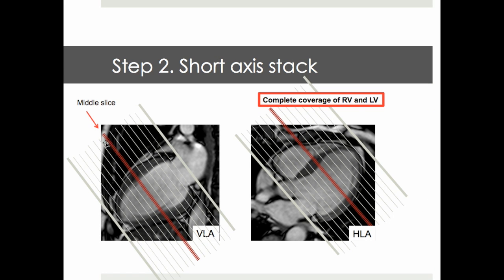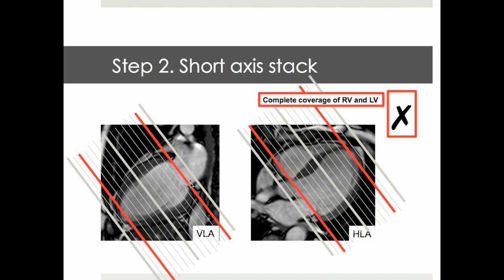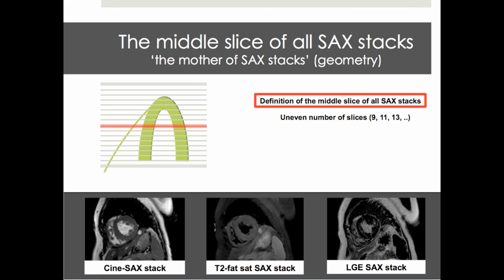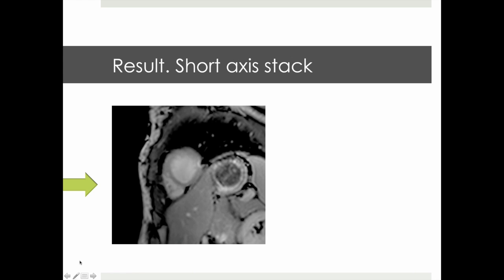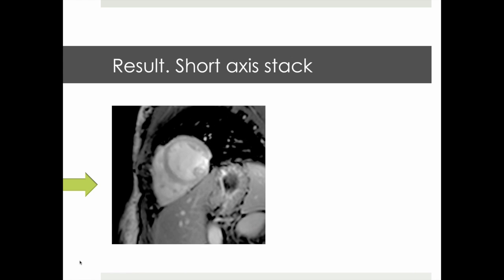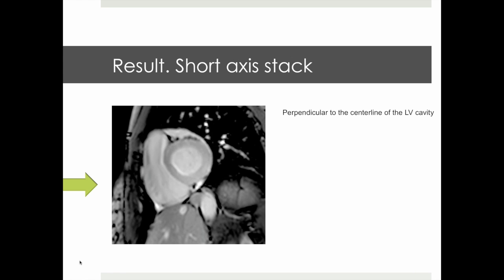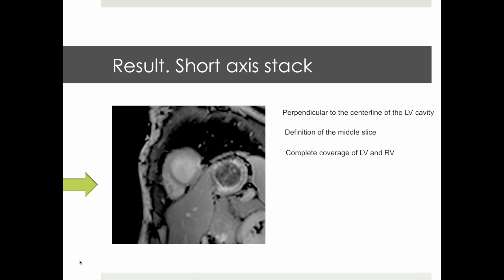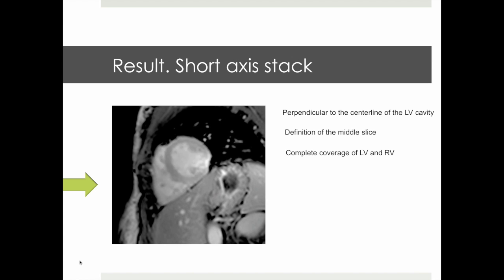Having defined the middle slice of our short axis stack, the next point is to achieve complete coverage of right and left ventricle, avoiding tight placement of the stacks and loss of information at the apex as well as at the base, which leads to underestimation of right ventricular and left ventricular volumes and LV mass. The middle slice defines the geometry of all short axis stack acquisitions — not just cine imaging, but also edema imaging or late gadolinium enhancement imaging. It is defined by the choice of an uneven number of slices.